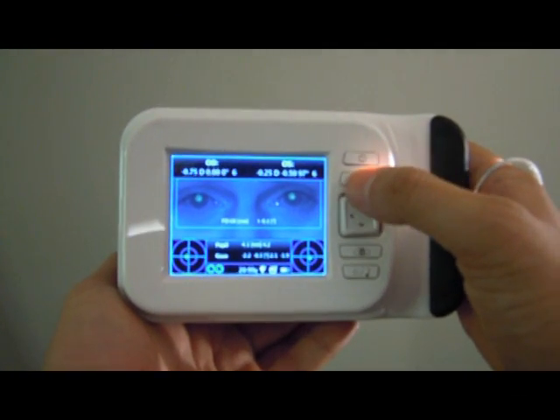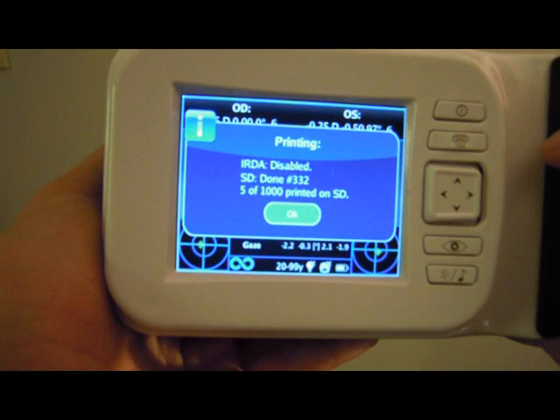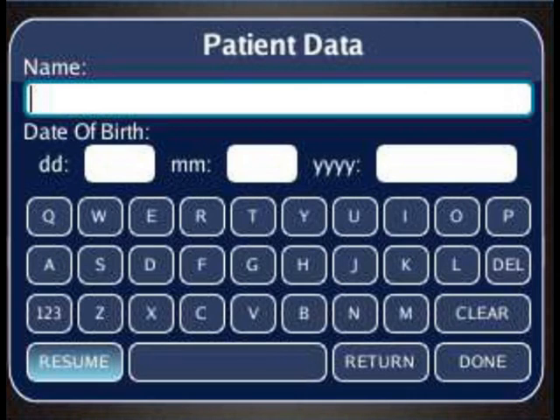In order to save the report, press the print button on the 2-WIN, then connect the 2-WIN to the computer through a USB cable. You will see a PDF report that can then be opened and printed. If you fill in the patient information on the 2-WIN, the information will be displayed in the report.